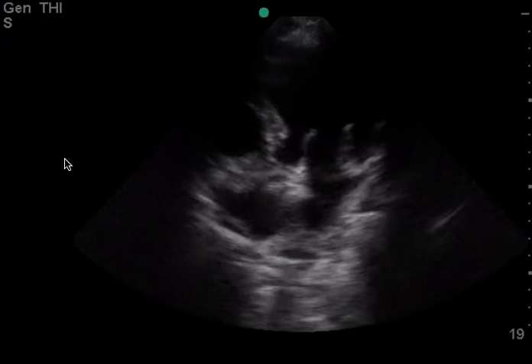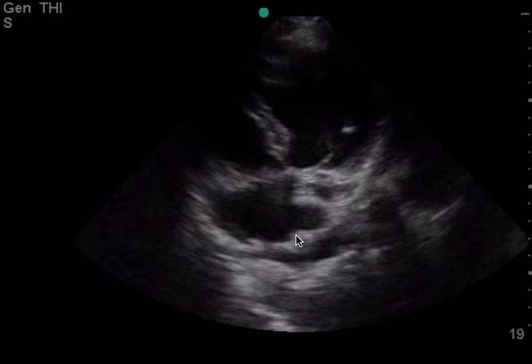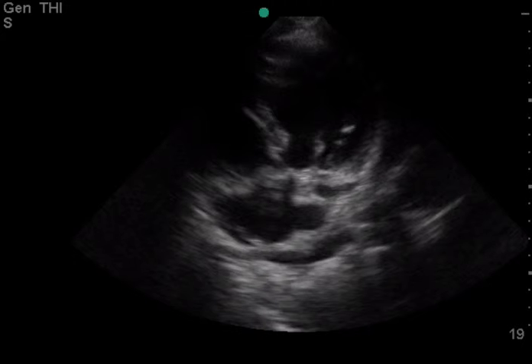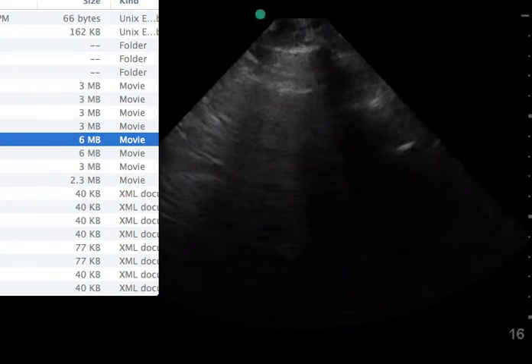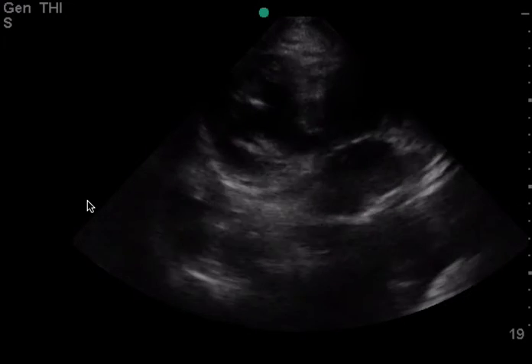effusion. Looking at your 4-chamber view here, you can see there's a decreased ejection fraction, and maybe there's a pericardial effusion here. But again, next time if you can, try to manipulate the probe a little bit so you have a nice parasternal long, and you can tell if that fluid travels circumferentially around the heart to really make sure there's a large pericardial effusion.